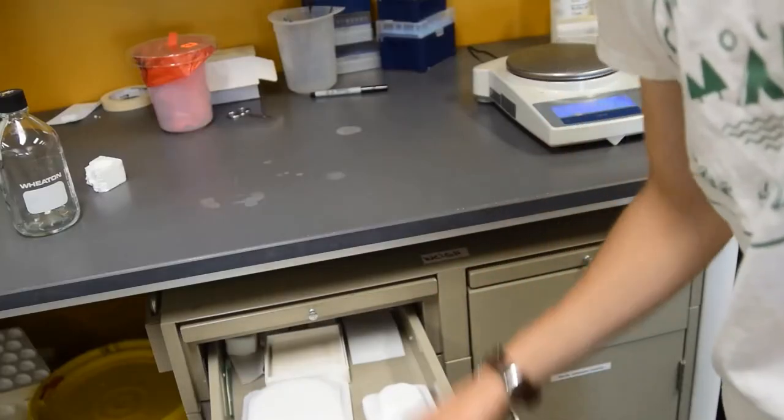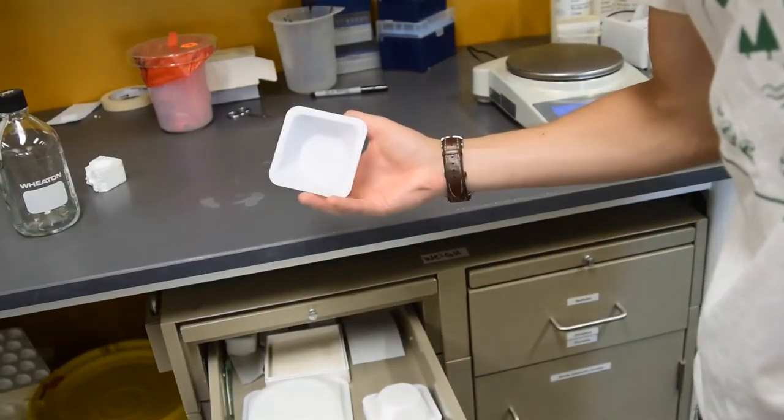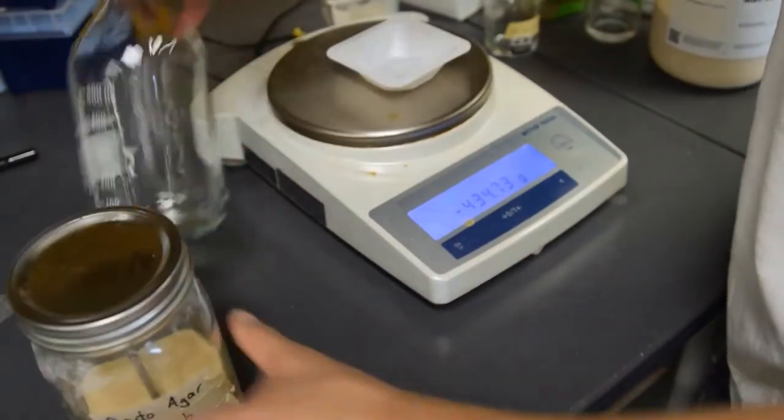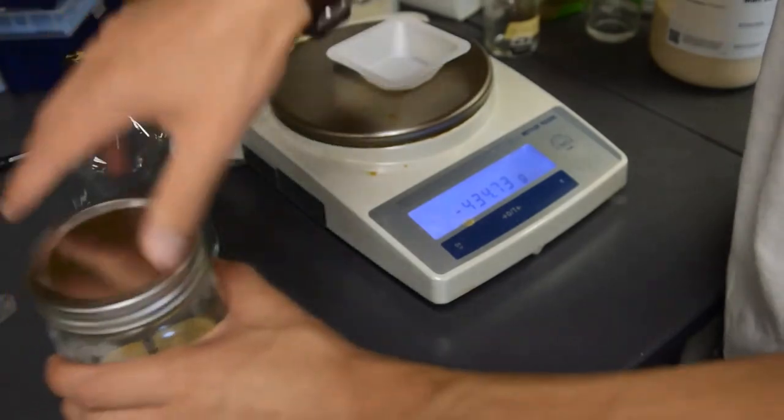Next we will need a weighing dish in which we're going to put the ingredients to weigh them out. These can be found under the bench. The first one, Bacto agar, already has a scoop in it and is kept in an airtight jar.